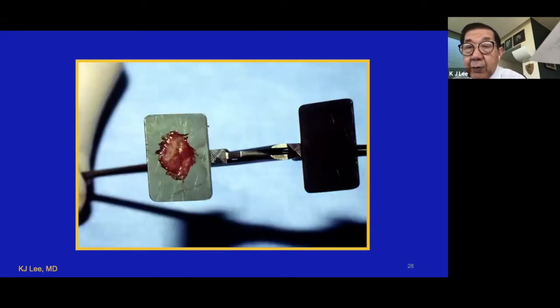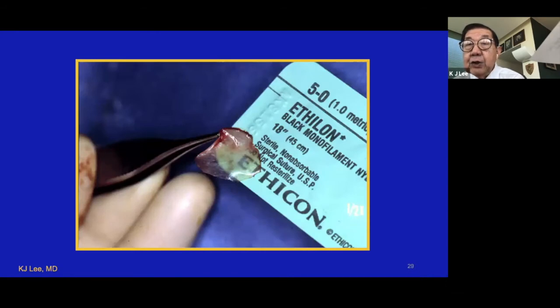And then I take a little what we call crusher, and we put it in there and we make one click. Don't click it to death. Just one gentle click, and I leave it at the back table of the operating theater. And when I finish with my mastoidectomy, then I now retrieve this fascia. Next. And it looks almost like a tympanic membrane. And you want it so thin and yet intact that you can read through it like the alphabet E. Next.